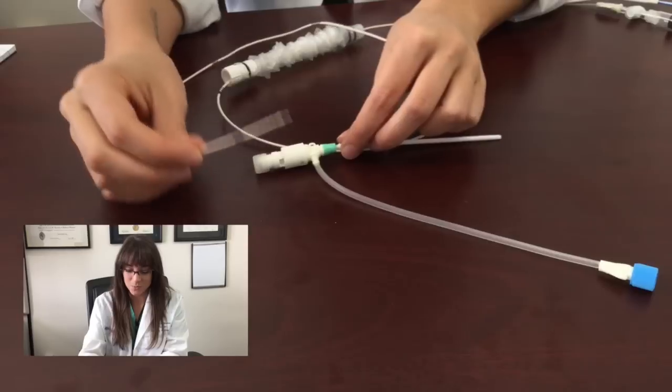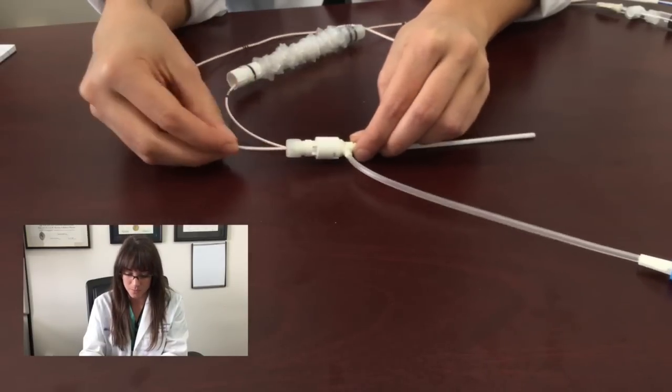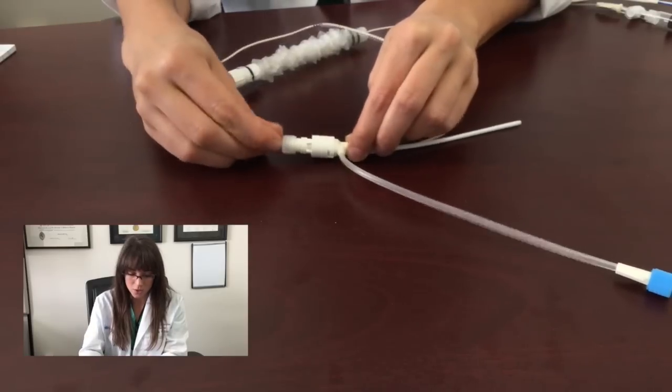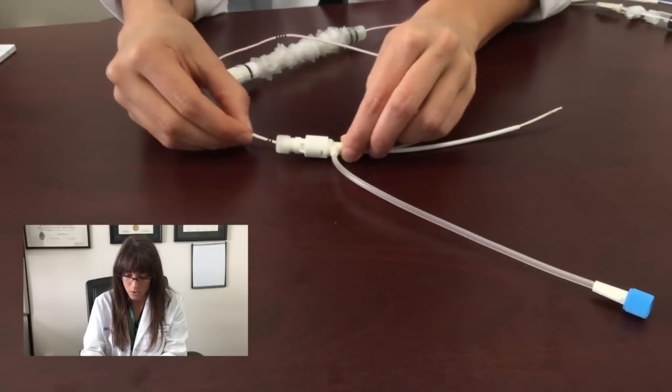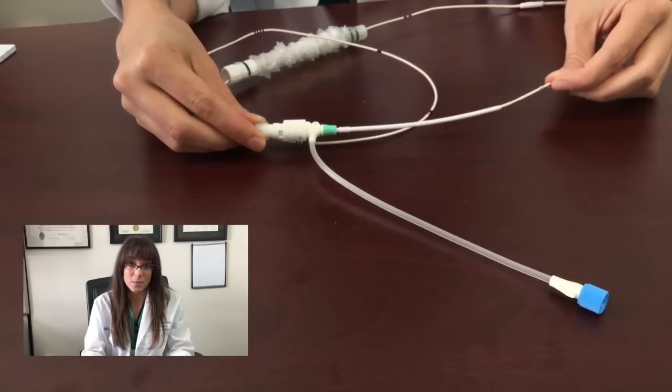Now it is time for the wire. You are going to take the tip of the pacemaker and place it through that introducer sheath that we just placed. Now you are going to advance until the two black lines. By stopping at the two black lines you ensure that the distal tip of your pacemaker is past the cortis.